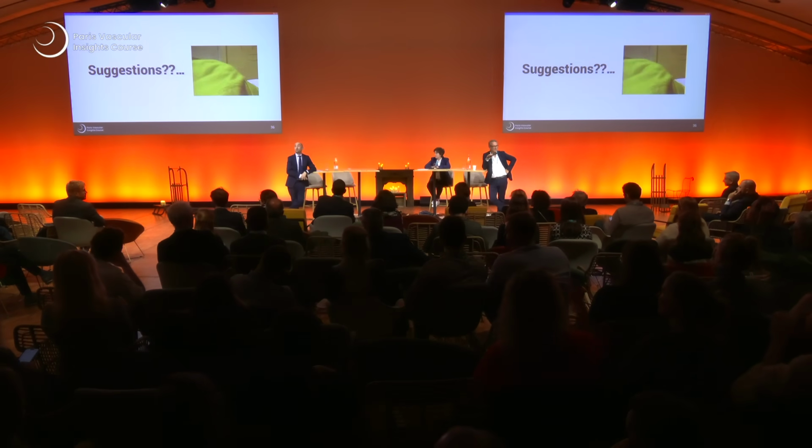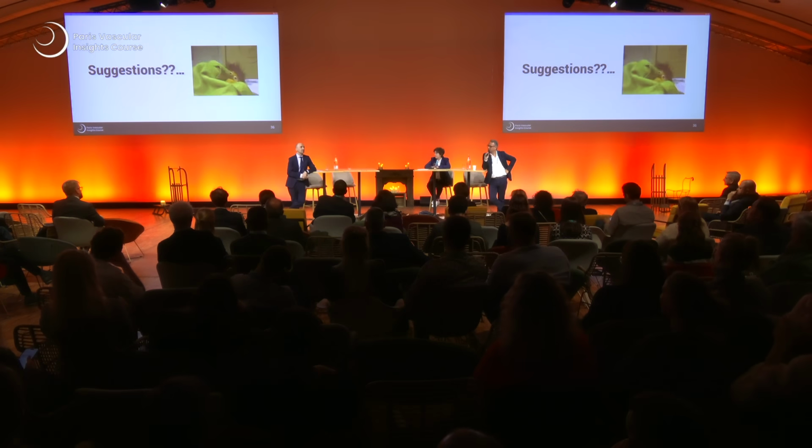Okay. Remaining, what we did, transradial? Yeah, there's some transradials. That's what we tried first, transradial. We don't have much experience, so we asked our neurologist, interventionalist, and cardiologist to join us and help with that.